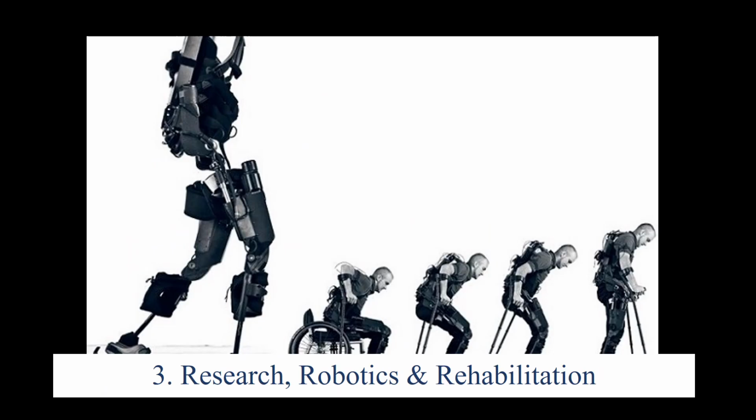Third one, research, robotics, and rehabilitation. Rehabilitation training provides the opportunity to patients for recovering their limb movement functions to the maximal degree so they can live a better quality of life. Nowadays, robotic systems are widely in use as rehabilitative tools to train up the physical impairments.